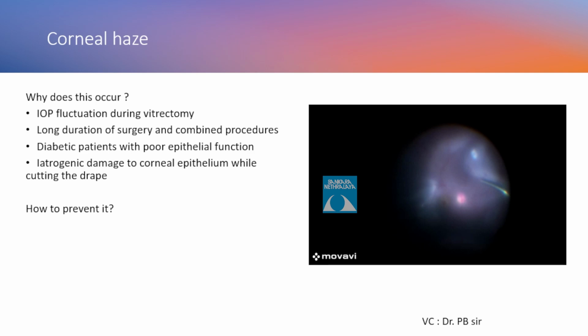Okay? All right. And trying to hydrate too frequently also produces corneal edema, because the saline is probably not the best hydrating solution, wetting solution for the cornea. That can actually produce hydration as well. So while if you put viscoelastic, sometimes it is good, but the methyl cellulose also tends to stick to the cornea and produces the kind of precipitation which itself can interfere with visualization.